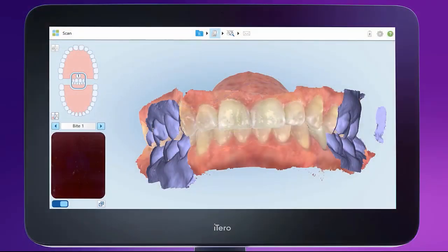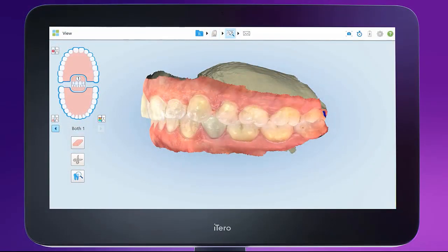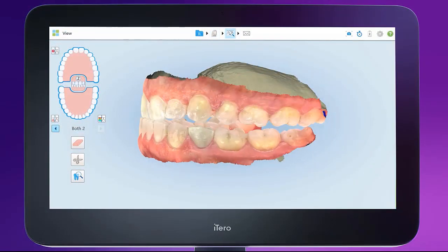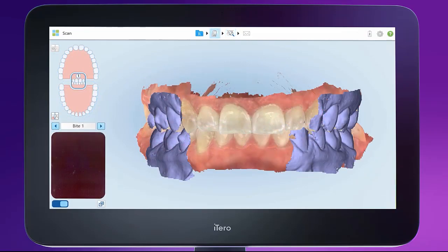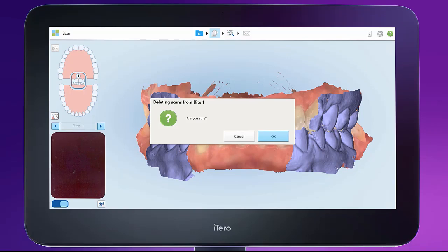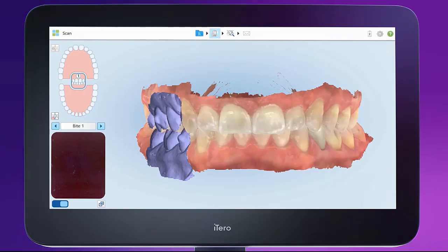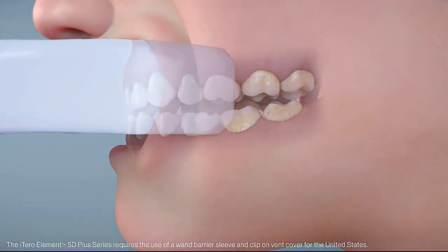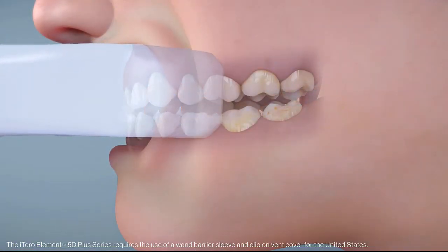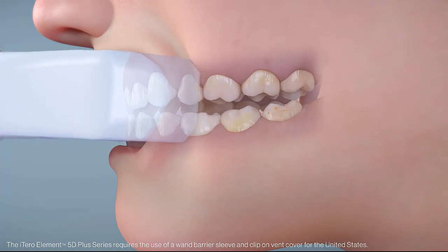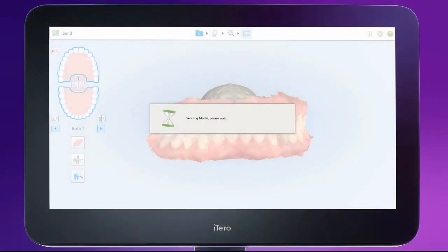Once you have registered both bites, review your model to confirm the bite is in the desired position. To make a correction, simply touch and hold the segment you wish to delete and then rescan as needed. Review your scan, save, and send as reviewed in the previous video.